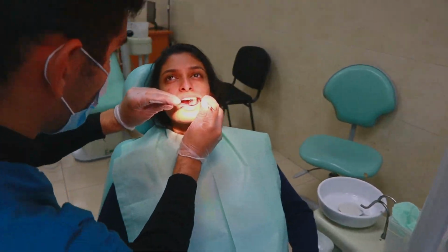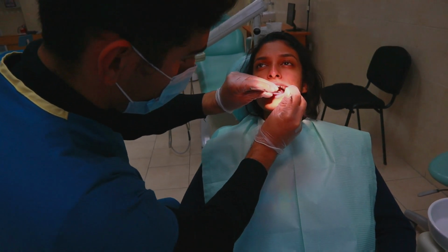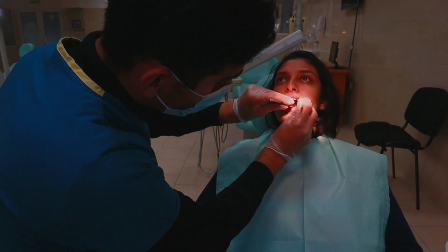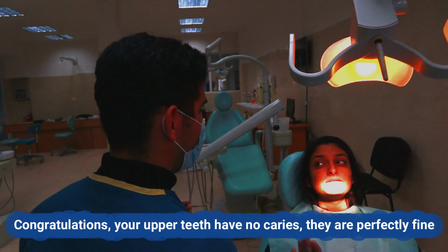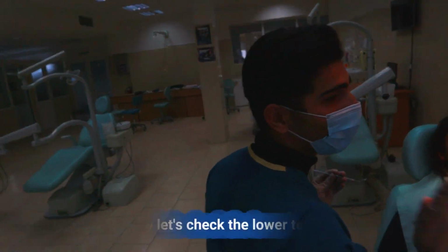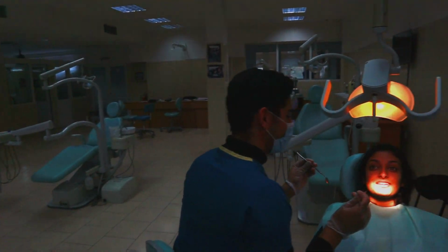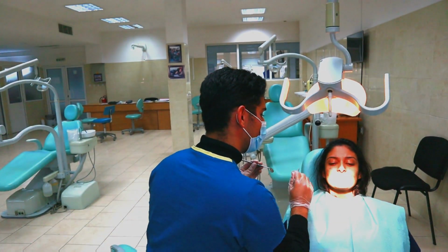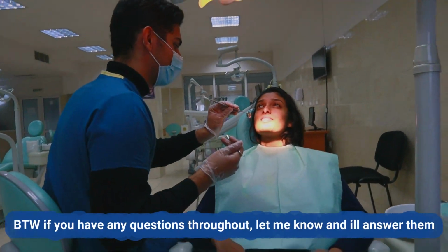Next tooth. And just like that, I examined all the maxillary teeth, from her right molars to the central incisors to the left molars. Congratulations, your upper teeth have no caries, they are perfectly fine. Now let's check the lower teeth. Time for examination of the lower teeth, which is done in the exact same way as the upper teeth. But if you have any questions throughout, let me know, and I'll answer them for you.